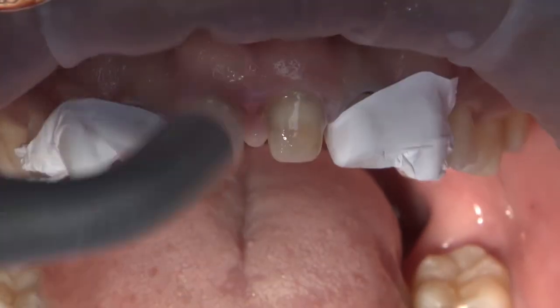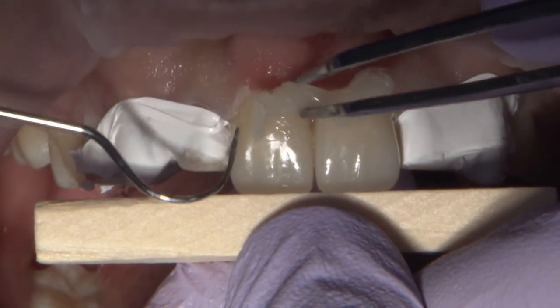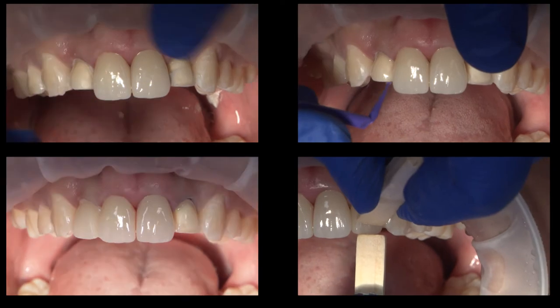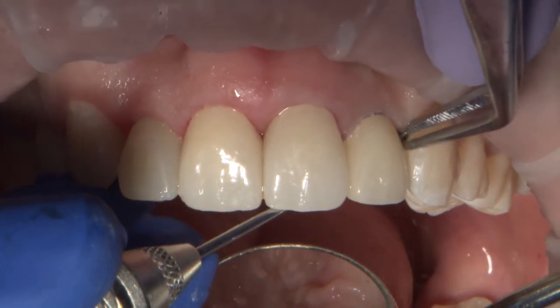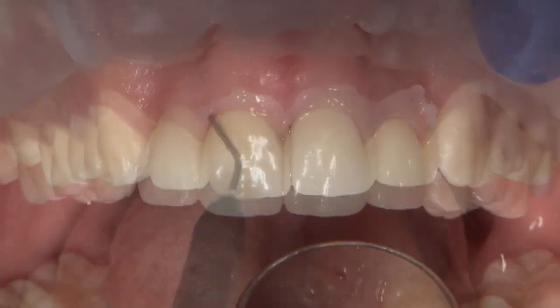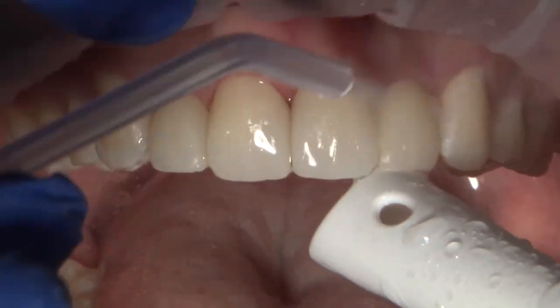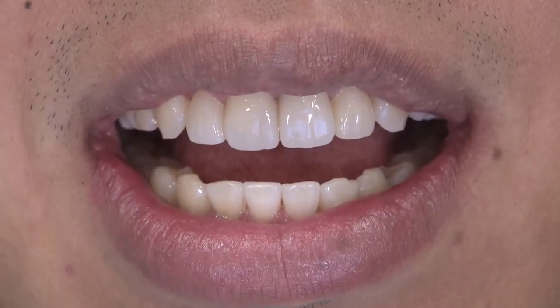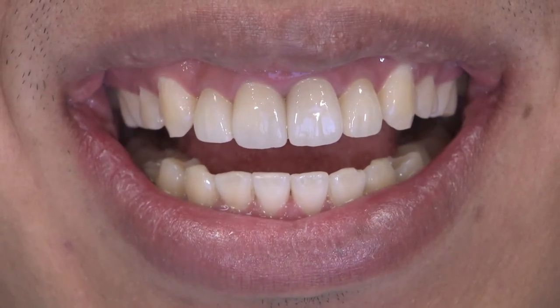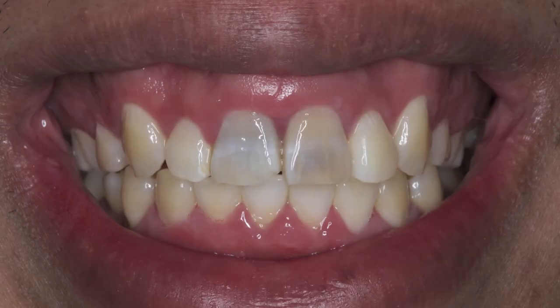Multilink Automix translucent dual-cure luting cement is used to first place 8 and 9, and a 2-second tack cure is all that is needed to make it possible to peel away the excess. The same steps were followed and the veneers were seated with finger pressure and held in place with wooden sticks while cured. After removing the excess cement along with double-zero retraction cords, a strip of glycerin gel is extruded and light cured once more to prevent the formation of an oxygen-inhibited layer. Occlusion is checked and adjusted where indicated by articulating paper. This end result is drastic enough to noticeably change the look of the patient's smile and restore his youthful appearance.